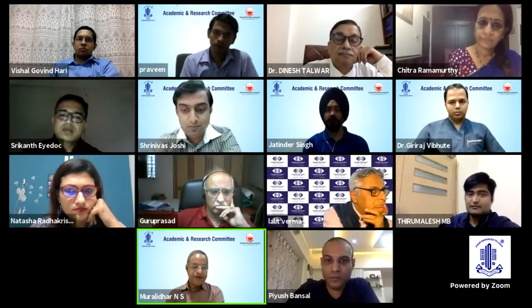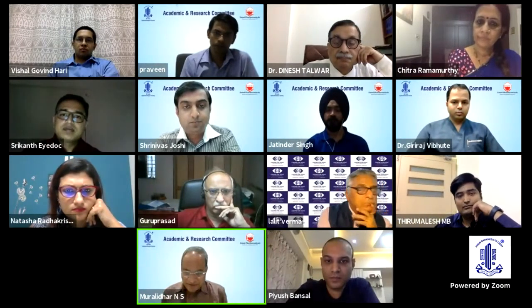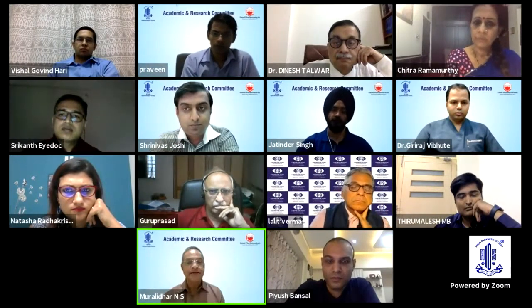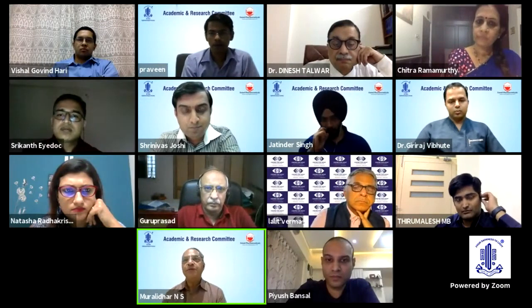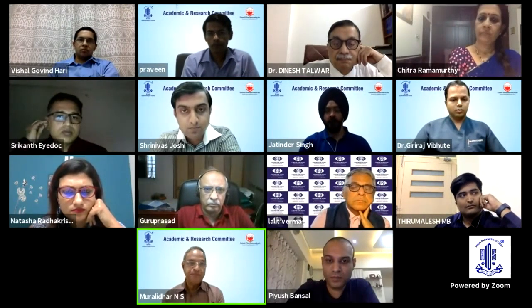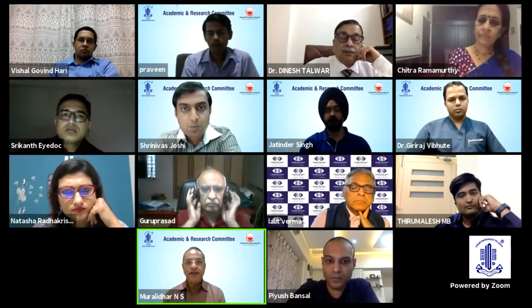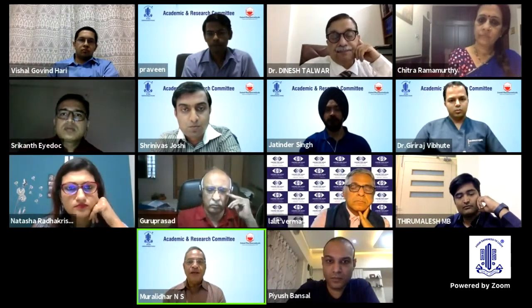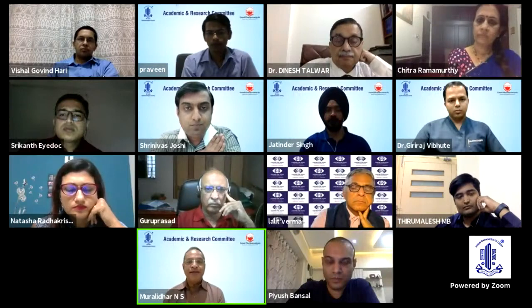Yeah, thanks, Srinivas. Good presentation by Srikanth. See, for a postgraduate, if in the exam you are given a fluorescein angiogram, as you rightly said, how to interpret it depends on whether you are given a single frame. Sometimes you have a large print of a single frame. In that situation, you have to identify the eye, whether it's the right eye or left eye, identify what phase of angiogram this is, and then go on to describe whatever abnormality you see.